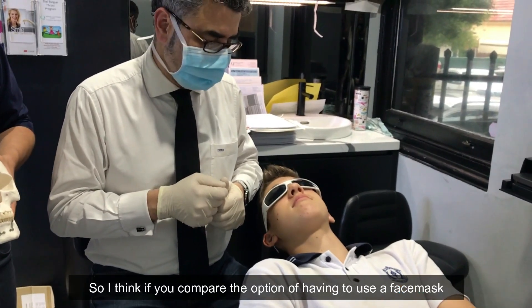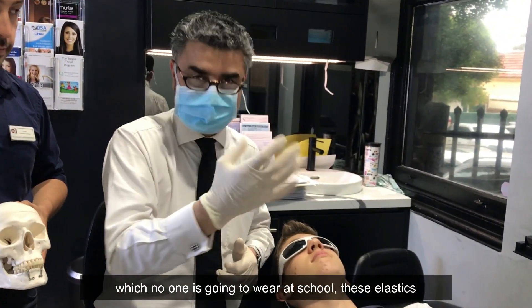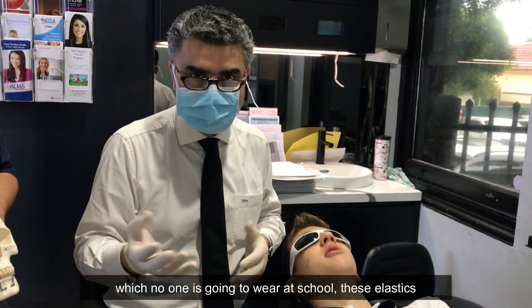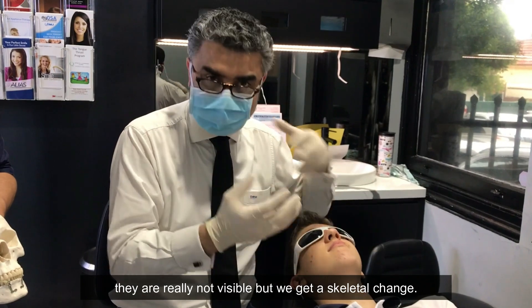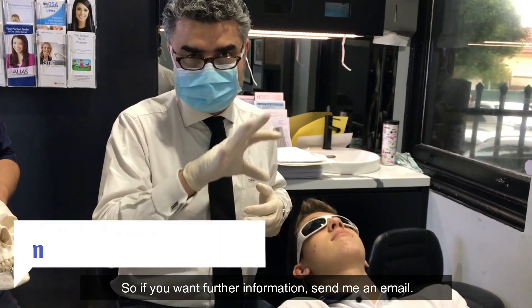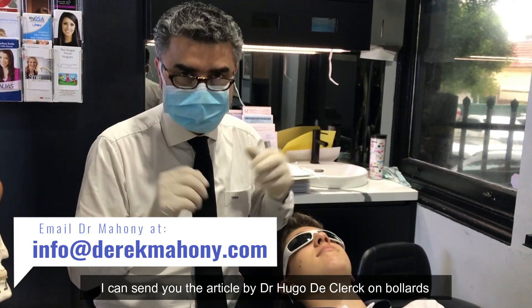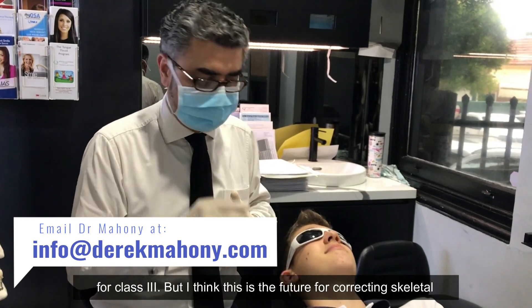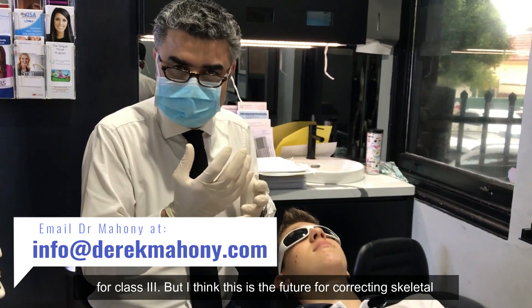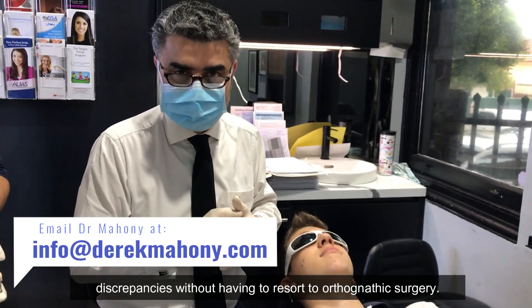Putting the elastics on — no problems there, yeah. If you compare the option of having to use a face mask, which no one's going to wear at school, these elastics are really not visible but we get a skeletal change. If you want further information, send me an email and I can send you the article by Dr. Hugo de Klerk on bollards and the long-term research on skeletal anchors for Class III. I think this is the future for correcting skeletal discrepancies without having to resort to orthognathic surgery.